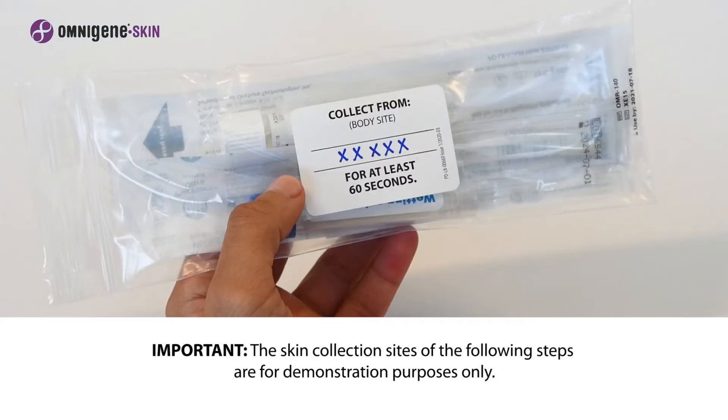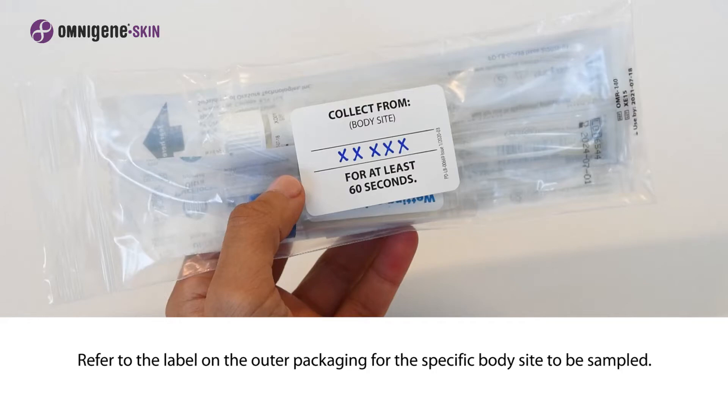Important: the skin collection sites seen in the following step are for demonstration purposes only. Refer to the label on the outer packaging for the specific body site to be sampled.